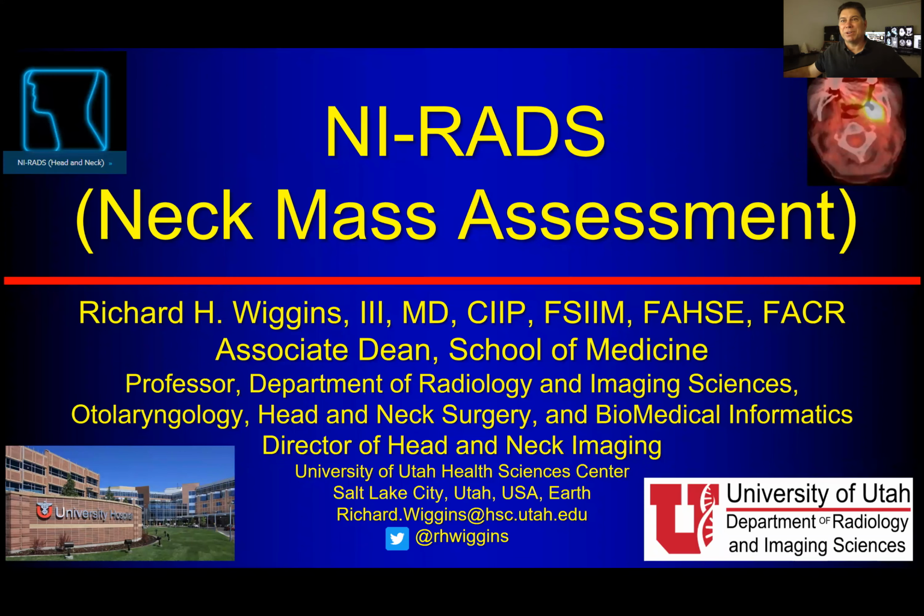I'm going to talk about NI-RADS, the ACR Neck Imaging Reporting and Data System that we use to talk about complex head and neck cases. You already heard about some of the other RADS systems. I'm going to specifically be talking about NI-RADS in this lecture.